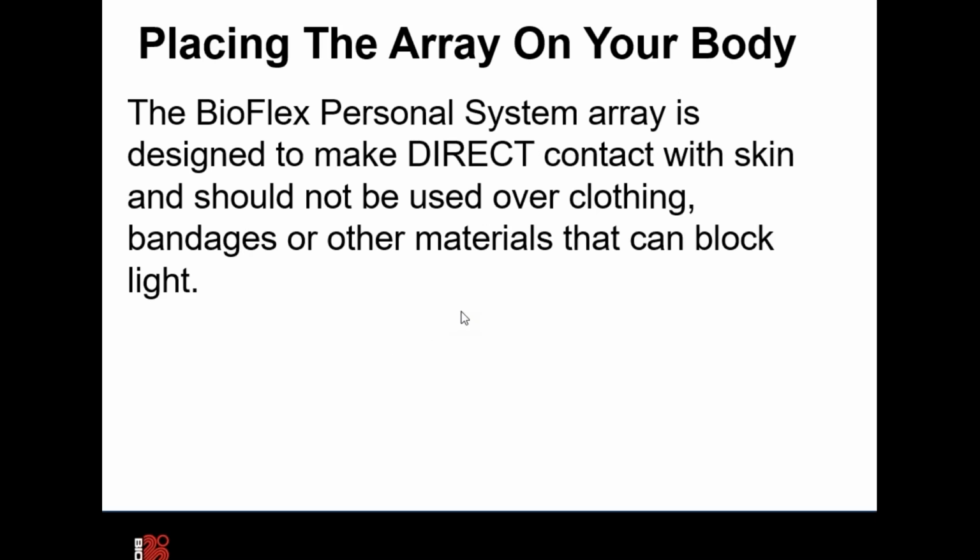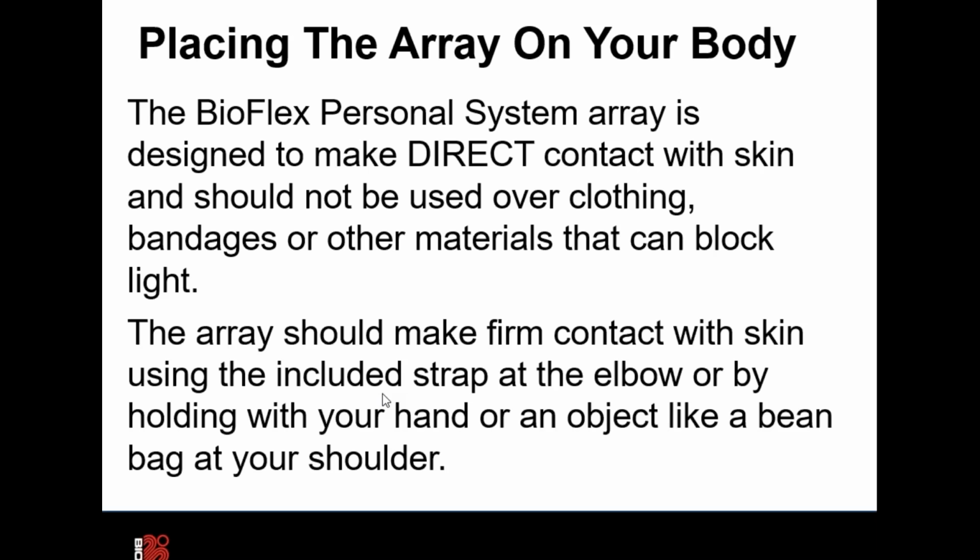These arrays are designed to make direct contact with the skin, so make sure that you remove any bandages, any supports, whatever you're going to put on the knee, take it all off. Make sure that you have direct contact with the skin. It should be in firm contact, so strap it around the knee in order to make really good contact.